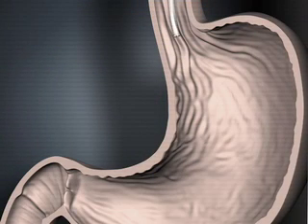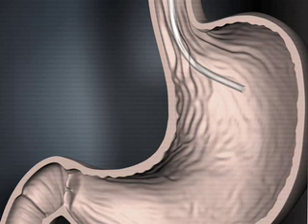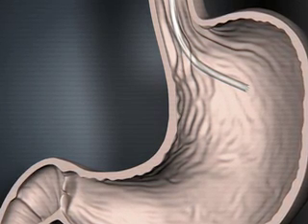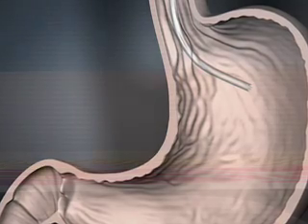Place the patient in the supine position. Insufflate the stomach with air using a nasogastric catheter until adequate distension is achieved. Using fluoroscopy, choose a location that allows as direct a vertical needle path as possible.